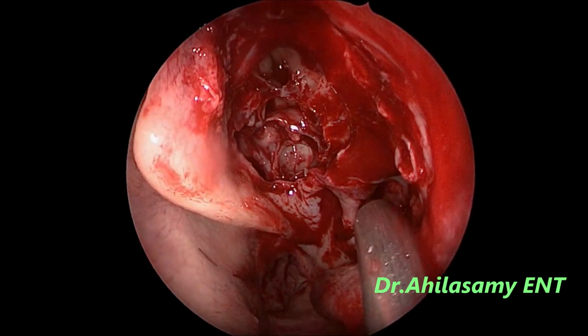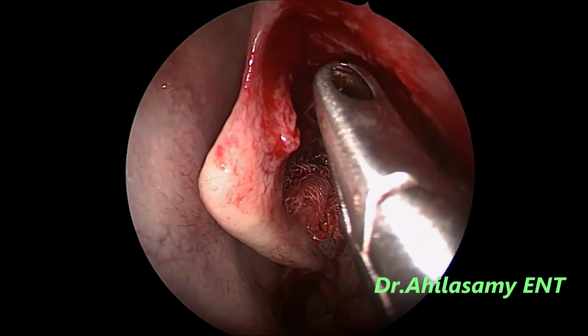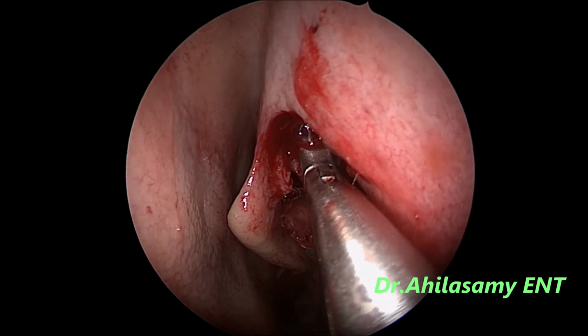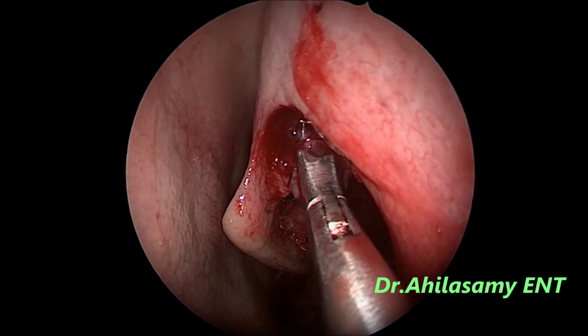Do not destabilize the middle turbinate. It should be rock solid, sticking to the septum. Otherwise, the postoperative result will be bad.